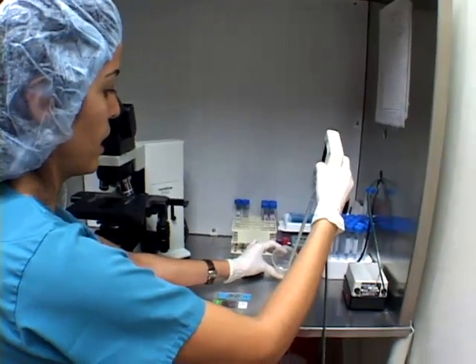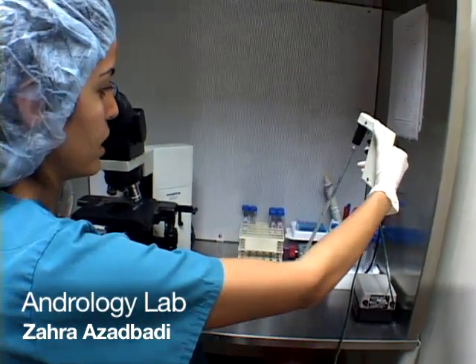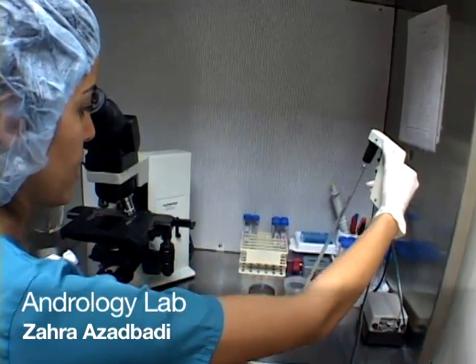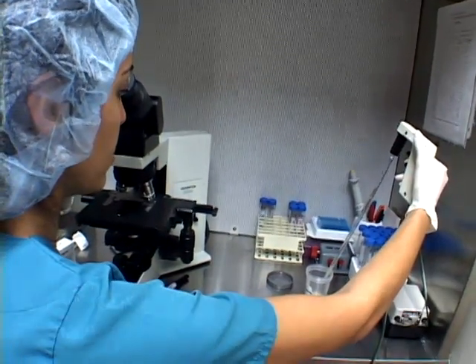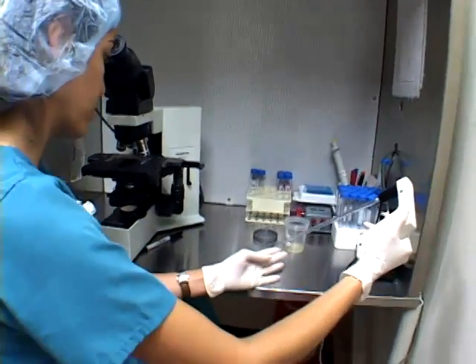I have to measure the volume of the sample as well. This patient has 5.3 cc volume of specimen. After I measure that, I'm going to put one drop here.